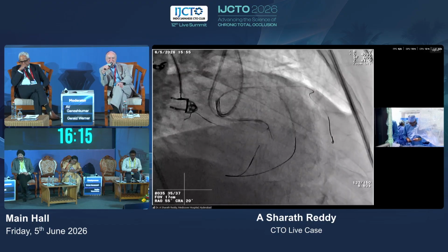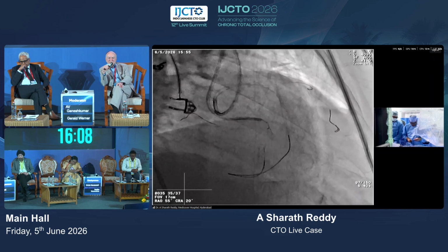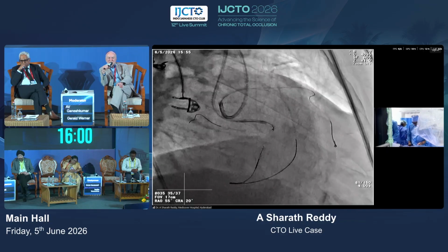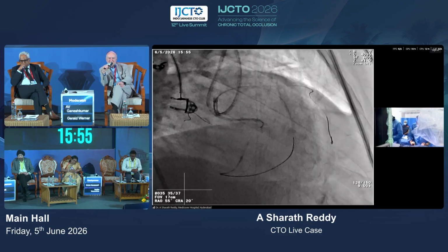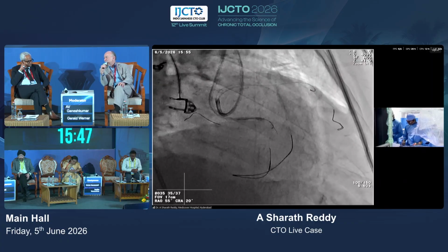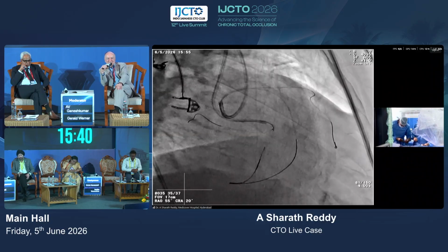So now my plan is I'm moving to my next step. I decided to knuckle antegrade with the balloon trapping of the microcatheter. So give me a 3 mm balloon, please. Power knuckle. Yes. But for the power knuckle, you actually need to pinch the proximal cap so that it works. It's almost like we are going around the proximal cap now. Okay.